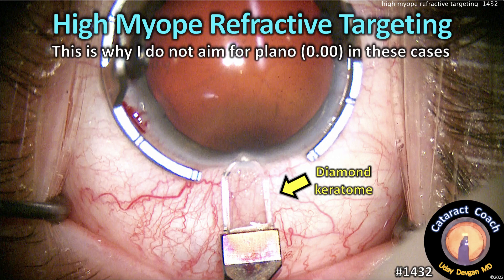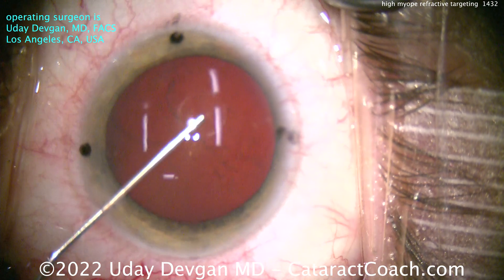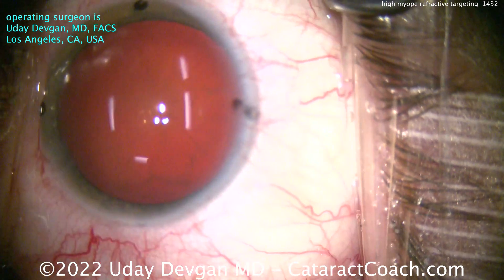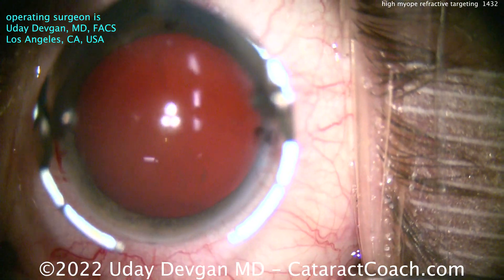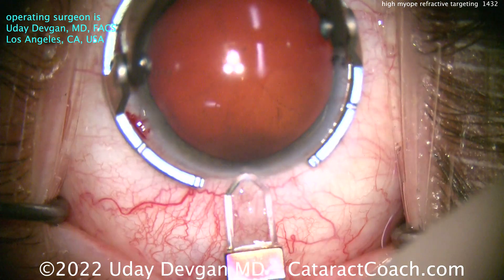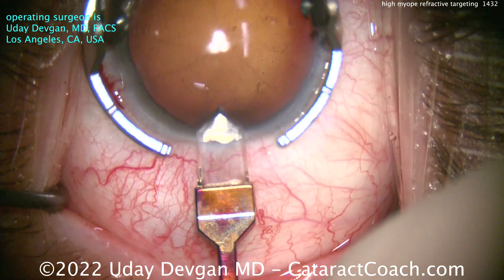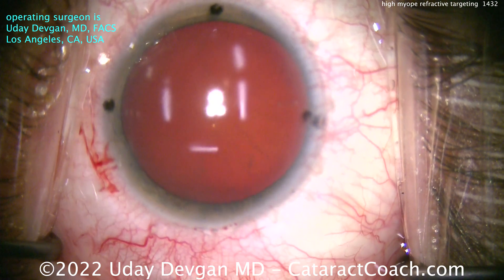This is why I do not aim for plano in these cases. Plano is our word for zero, 0.00. You would think that for a lot of eyes, hitting that zero refractive target would be ideal — and it is. That's the sharpest possible distance vision, which is great for all kinds of patients and all kinds of lenses, but not for the ultra-high myope. Why is that?